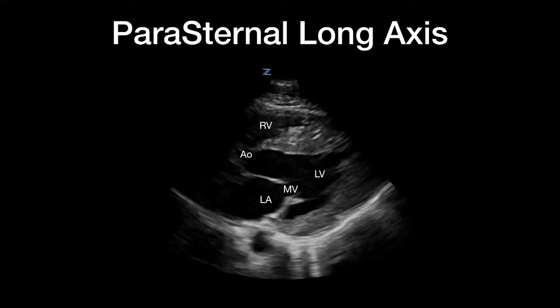There are a few other anatomic structures we can also see in this view. First, between the right ventricle and the left ventricle, you can see the muscular intraventricular septum. Also, deep on the screen and posterior to the heart, there is an anechoic, or black, round structure that is a small portion of the descending aorta. If you now focus superior on this image, or anterior, bordering the right ventricle, you'll see a hyperechoic, or white line that outlines the heart. This is the pericardium. It can be seen both anterior and posterior in this image. Last, in this still image, you can see the posterior leaflet of the mitral valve connecting to the chorda tendineae and then to the papillary muscle.